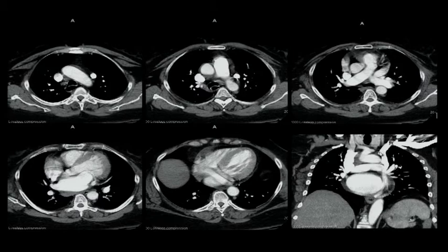So this is the right SVC, this is the left SVC, correct? They both are vertical like that and they give a box-shaped appearance around the aorta. This is the left side SVC, this is the right side SVC, and the catheter was traversing the left side SVC. Okay, and they say the left side SVC drains directly into the coronary sinus, am I correct? What is this structure? This is the coronary sinus, okay? Correct? Next, who's next?